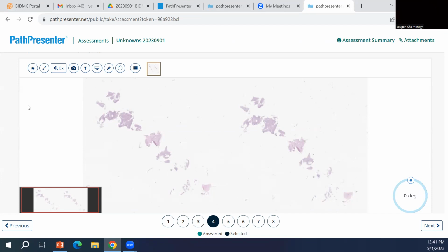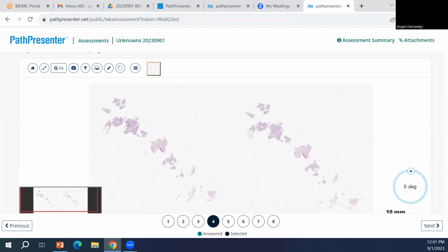Is this in any way linked to those peritoneal loose bodies that you sometimes see at autopsy? Oh, like those rice bodies? No, this is different. This is actually a neoplasm, right? Right. But often you'll find it incidentally, if you go looking in autopsies very carefully. So it's not that uncommon, but to form masses like this would be very uncommon. Yeah, we didn't expect it. It was pretty weird for us.